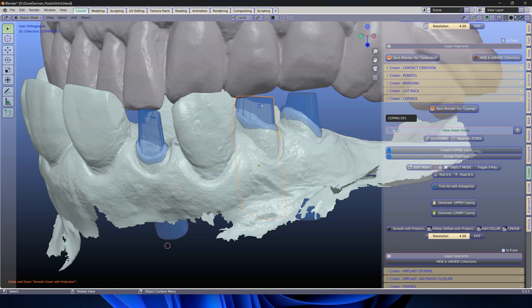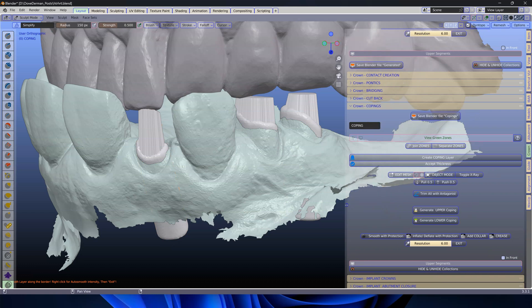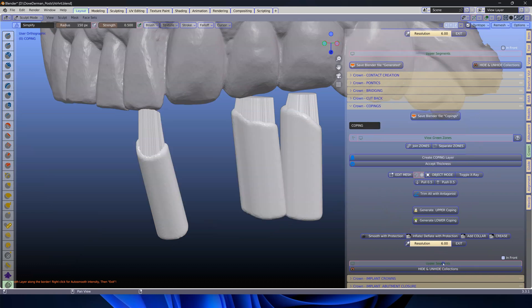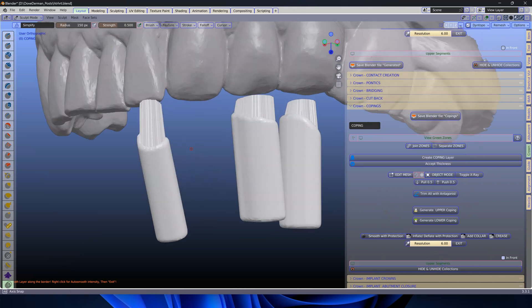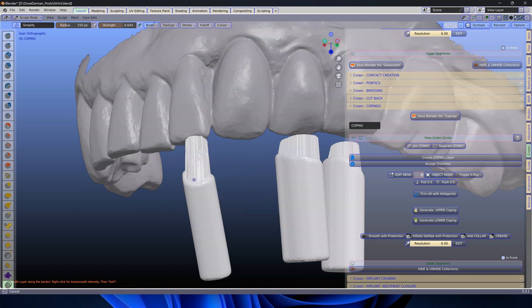Next I'm going to select them and smooth. I'll set my auto smooth a bit down and my strength up a little bit like that.